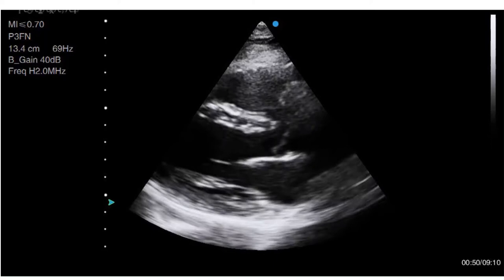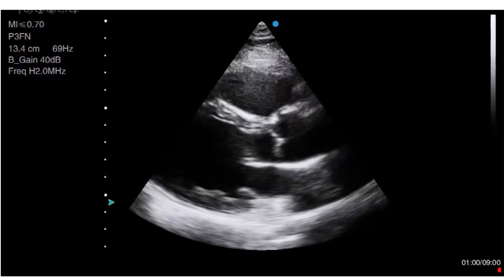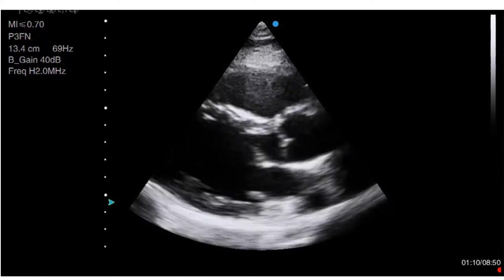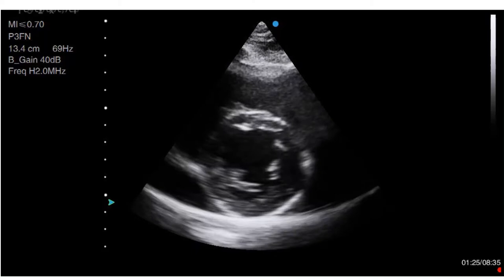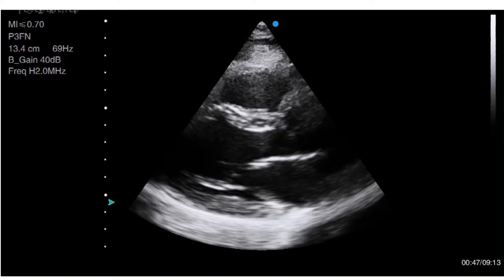The third view I'd like to show you is the short axis view. You are not moving from place — you are simply rotating 90 degrees. That is why it's so important to perfect that first long axis view, because once you've found that window, you really do not need to move from it when you are performing a cardiac screen. This is the short axis view at the level of the papillary muscles. From here you can not only see and measure wall thickness, but you also have an excellent view of left ventricular systolic function — of how well the walls are squeezing into the cavity.